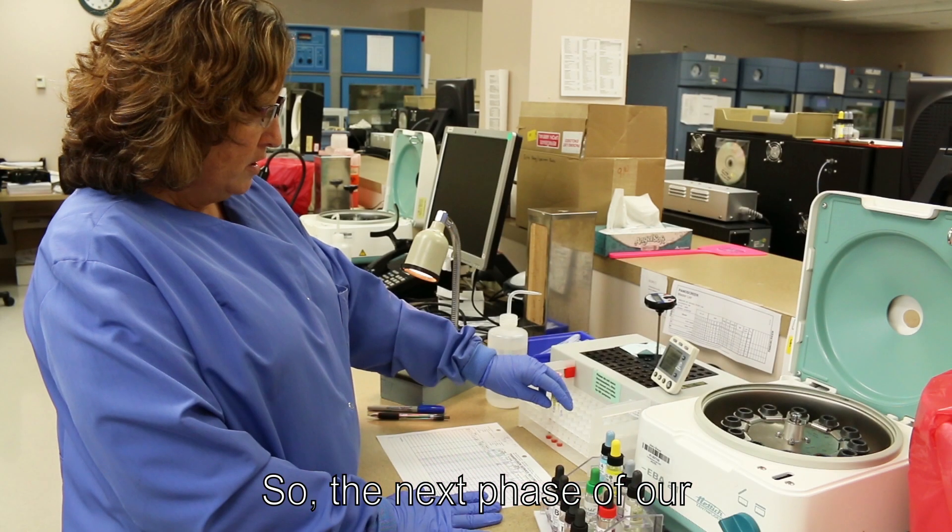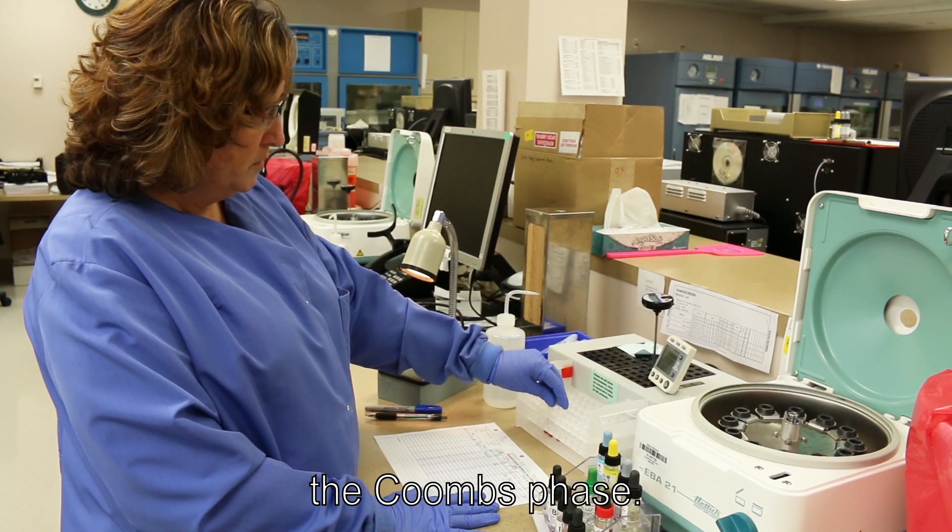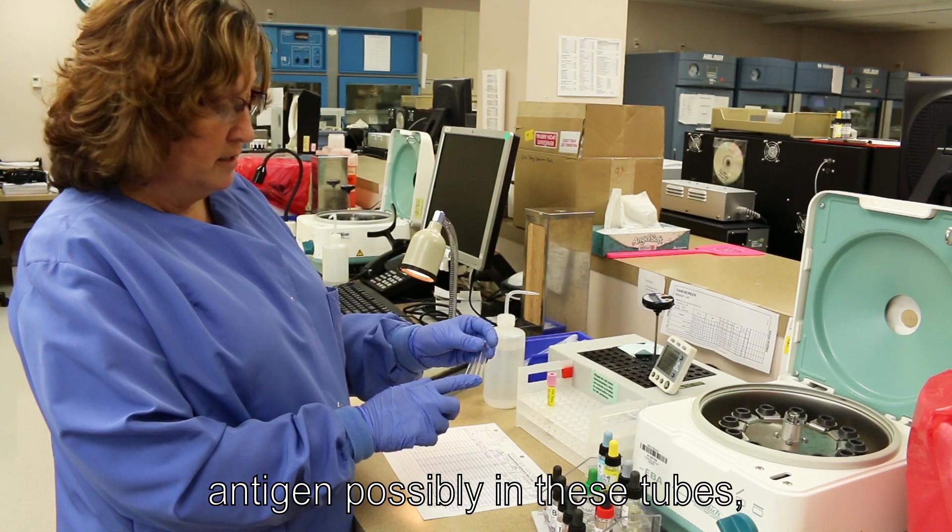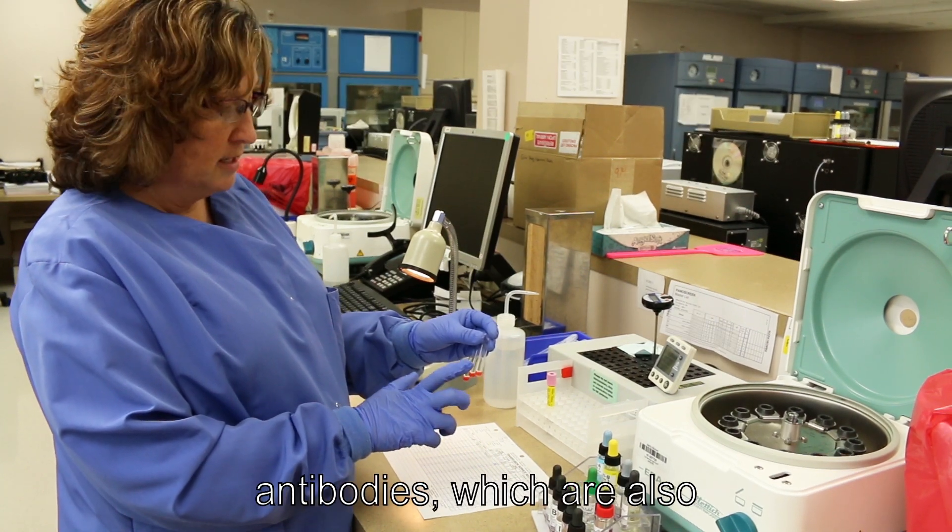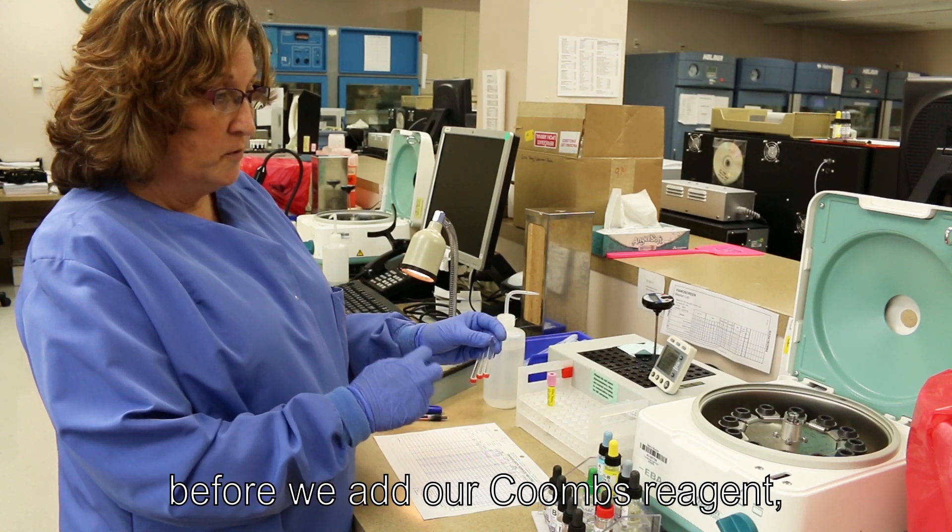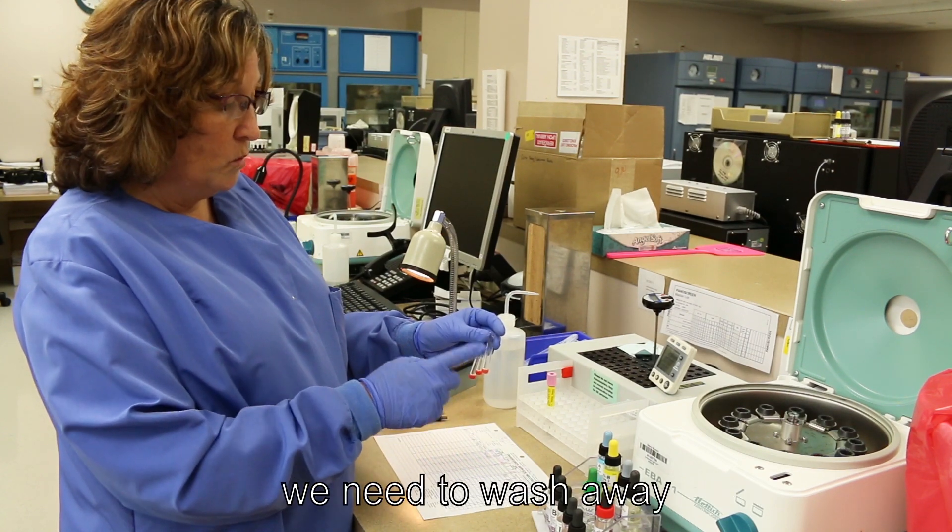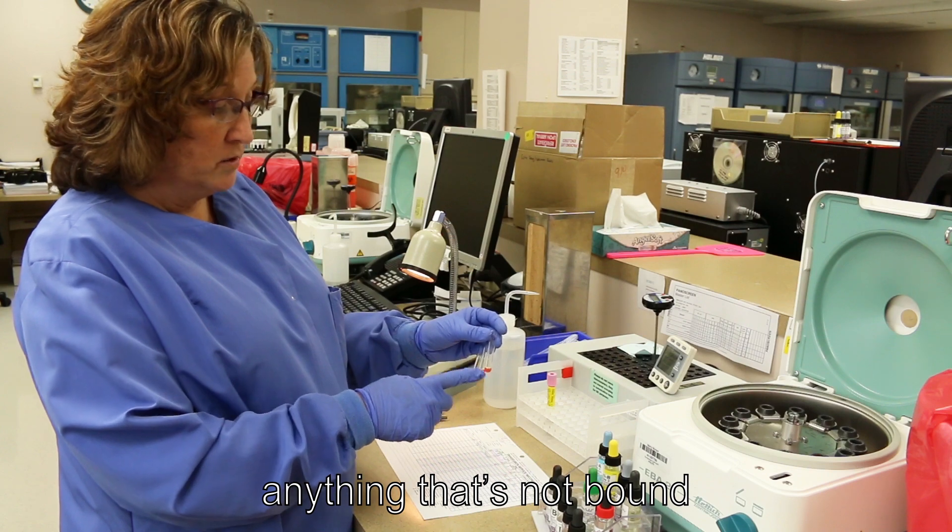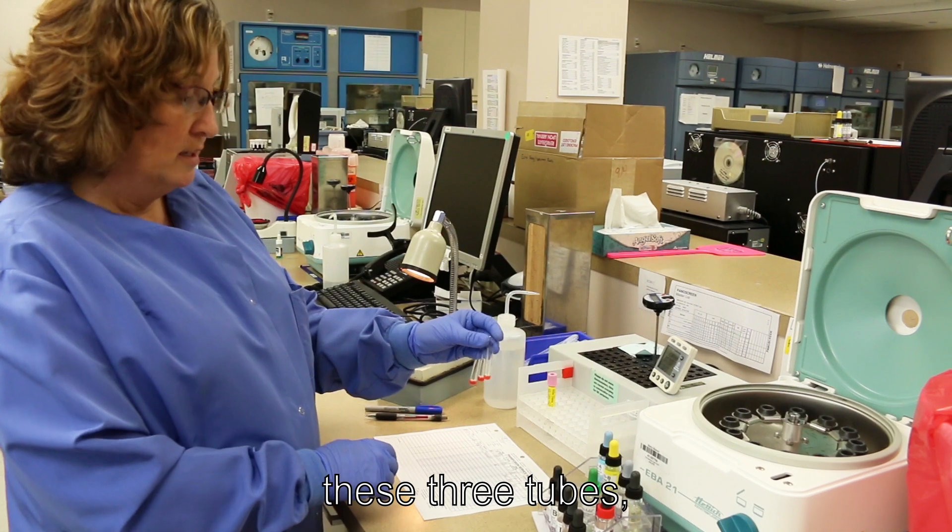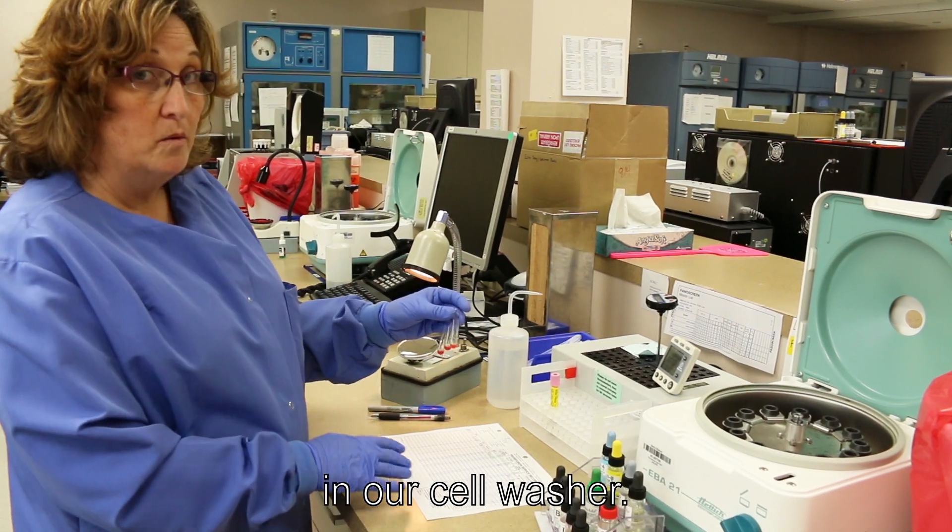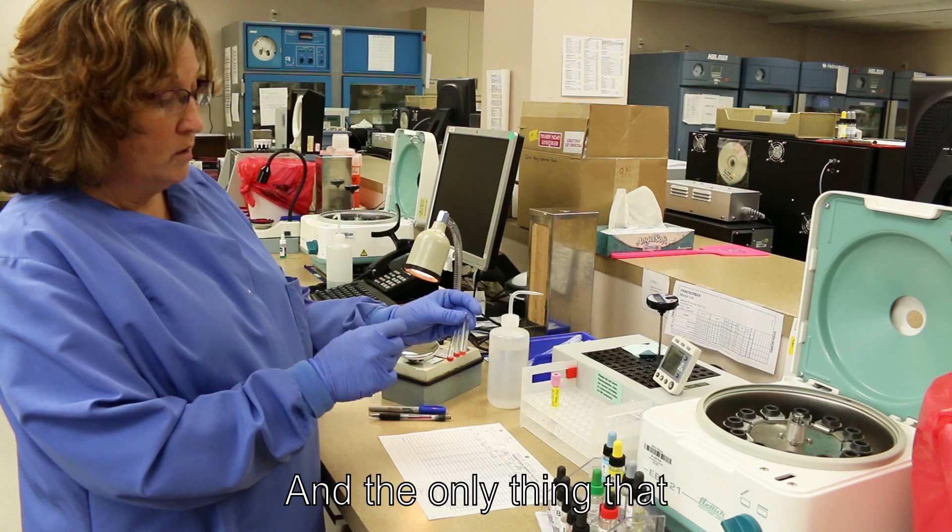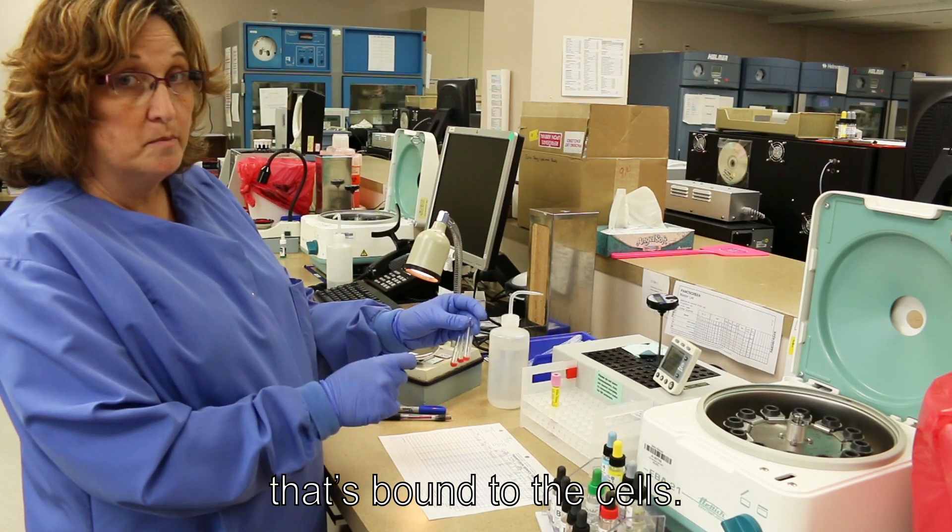So the next phase of our antibody screen is to do the Coombs phase. But one thing we need to keep in mind is there's antibody bound to antigen possibly in these tubes. But there's also extraneous antibodies which are also called proteins. So at this phase before we can add our Coombs reagent we need to wash away anything that's not bound to the antigen that's on these cells. So after our 37 degrees we're going to take these three tubes and we're going to put them in our cell washer. And it will dispense saline and wash up the cells. And the only thing that will remain is antibody that's bound to the cells.